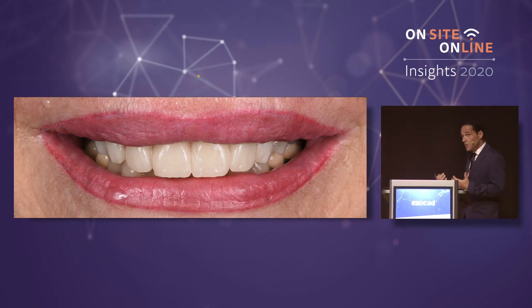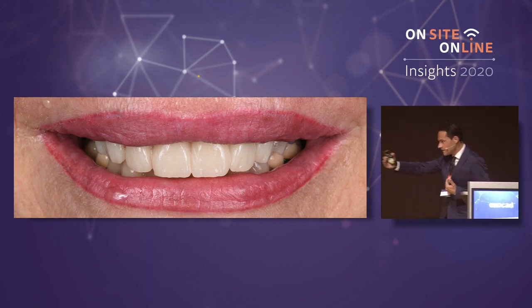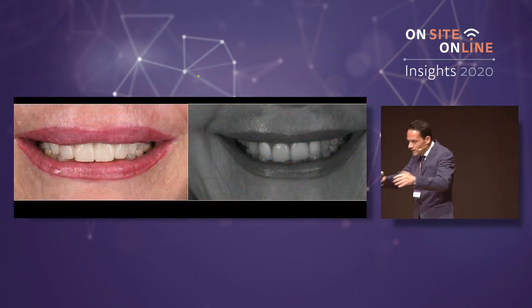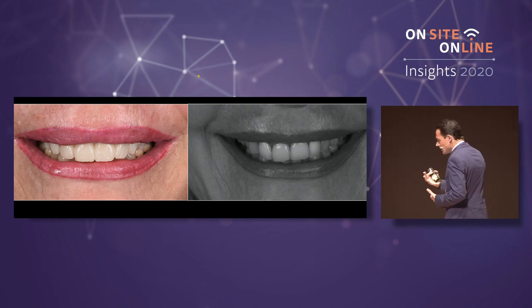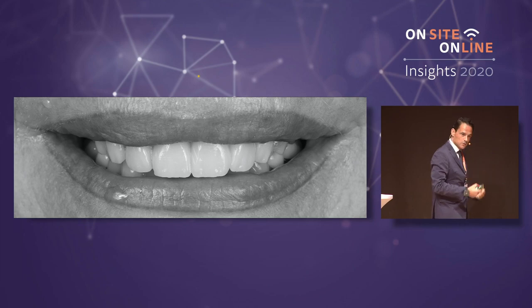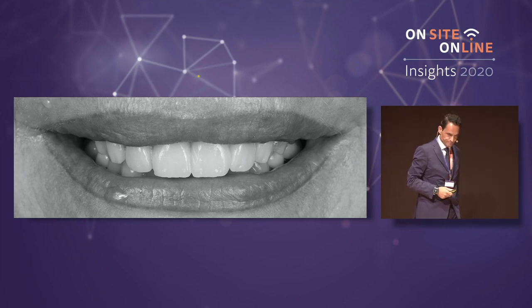Please show the mock-ups to the patients from a big distance point of view, because if you zoom in, you can see that it is an addition and that it is not natural. Record videos and show these videos to the patient. It is really helpful.